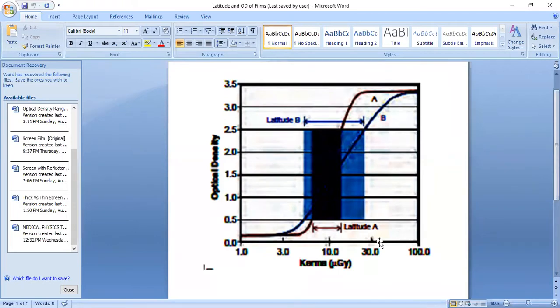You get another patient, which film will I use? You now calculate, blah, blah, blah. I should use film A, I should use film B. Another patient comes up, and for this patient, for us to have this good exposure, I also want a good contrast, let's use this particular film.